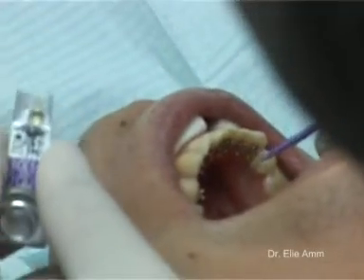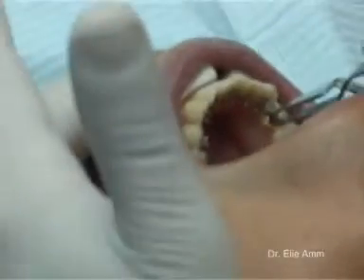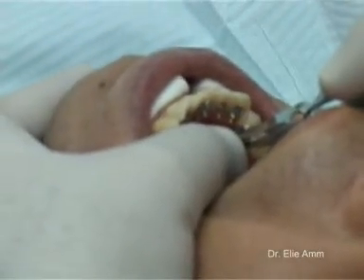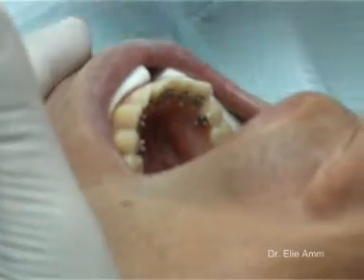Special care must be taken for the first bicuspid. The height of the bracket must be at the level of the labial part of the crestal edge. If the bracket is bigger than the lingual surface of the first bicuspid, the gap can be filled with composite.